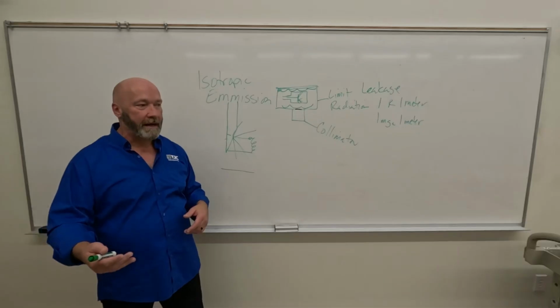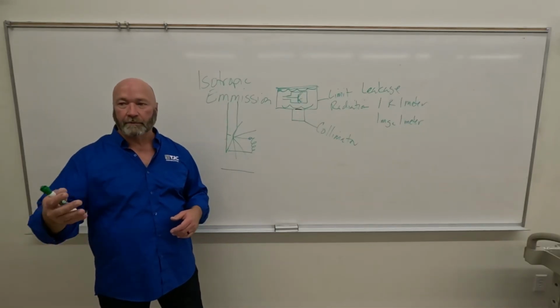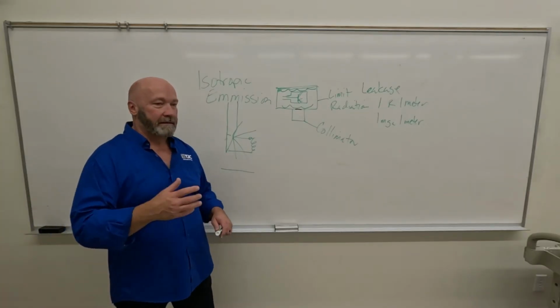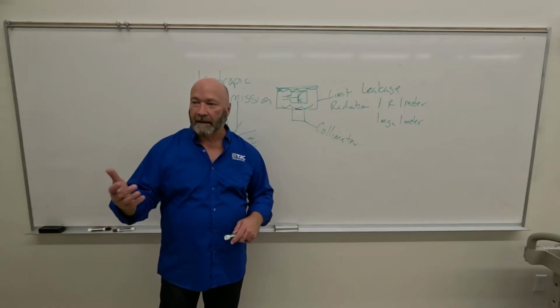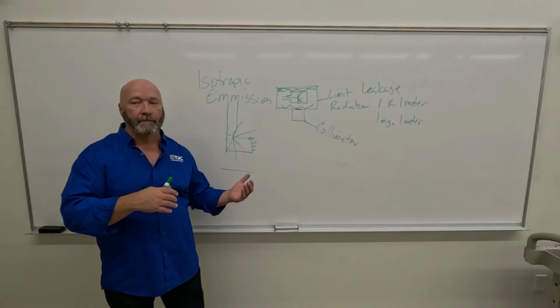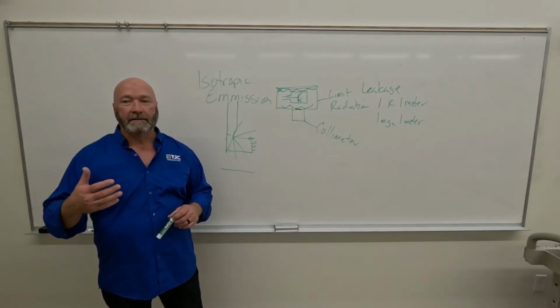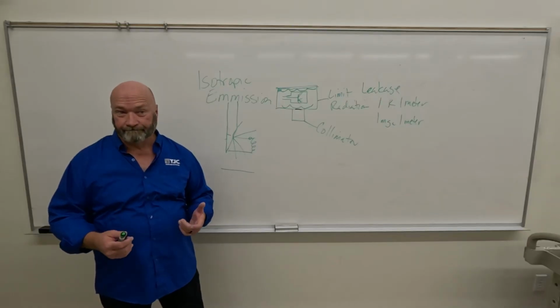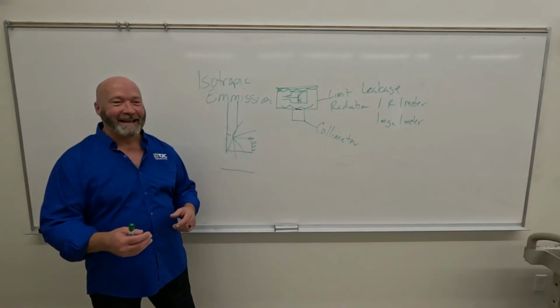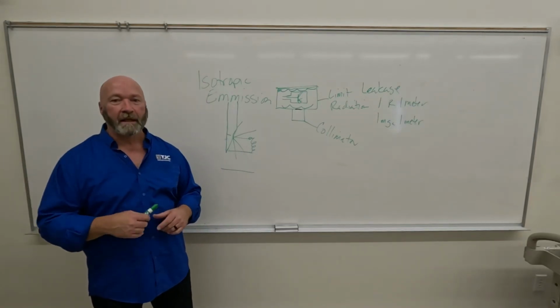You set 20 mAs and you might not get 20 mAs. So they didn't want that. So they went to a vacuum tube. So the envelope maintains that vacuum. Now sometimes the X-ray tube will start to leak. And by leak, it's going to lose some vacuum and it's going to suck some oil inside. As it does that, we get a gassy X-ray tube. So if we have a gassy X-ray tube, we're back to a partially pressurized tube. And what do we get?